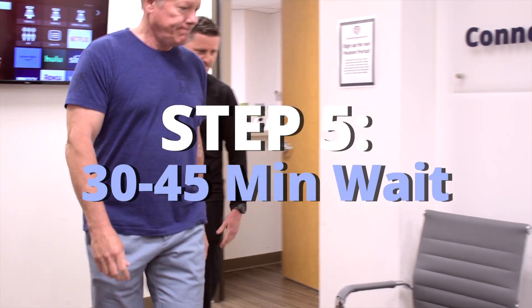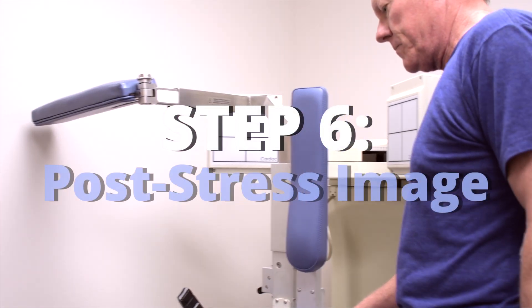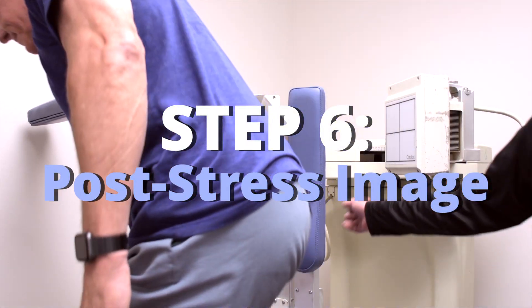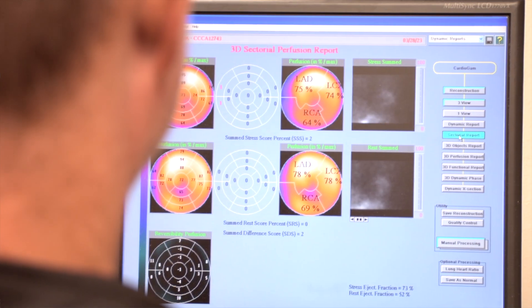Next comes a 30 to 45 minute wait period in the C3 waiting room. At this time, you may eat and drink water and coffee if you've been given the chemical stress test. Coffee is actually recommended because caffeine is an antidote to the chemical stress agent and may help with side effects. After this, you are taken back to the imaging area for five to seven minutes to get another heart scan with a resting heart rate.